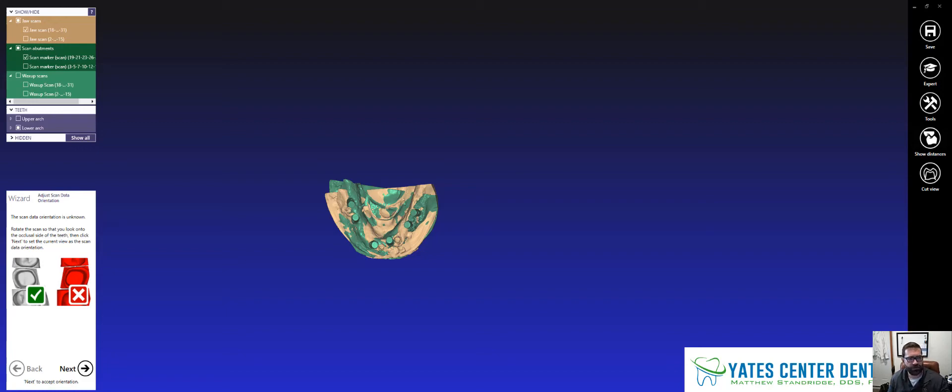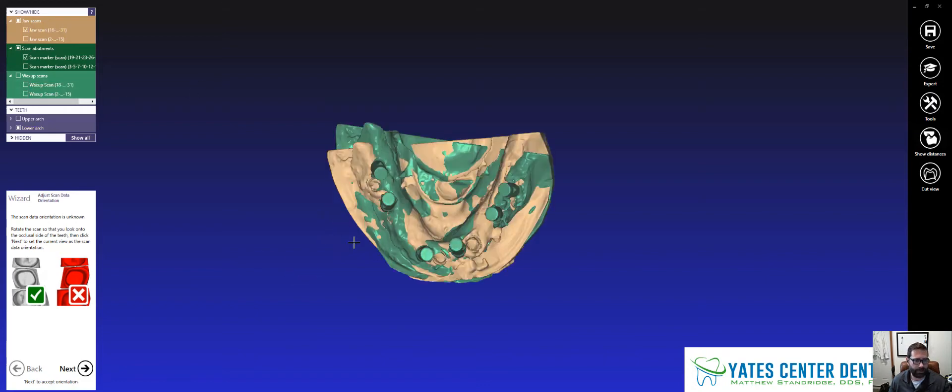Hey gang, Matt Standridge here. I'm doing a little video on ExoCAD because I'm working up, reworking up an implant case, and I wanted to show this.